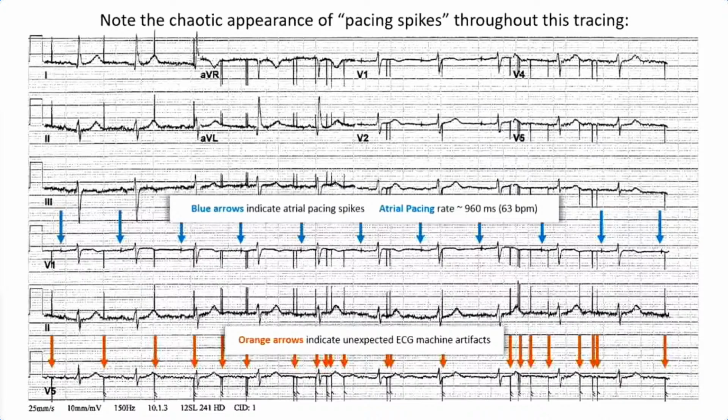Yeah, well, we're always told that the beauty of digital EKG machines and digital monitors, digital recording devices like Biotel monitors, whatever companies monitor, is that it shouldn't give you any artifact. But I've seen it in a number of patients. I've yet to have an engineer give me a satisfactory explanation.